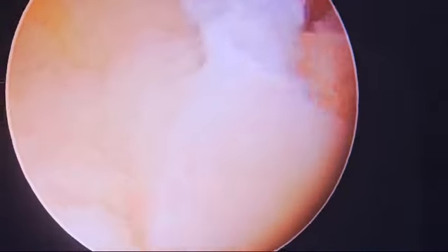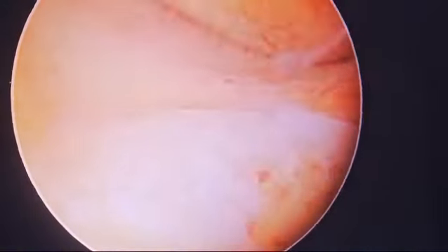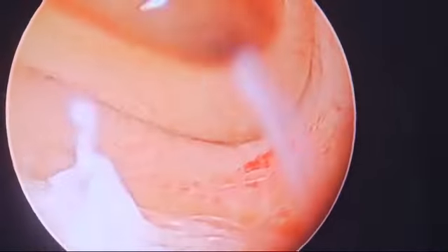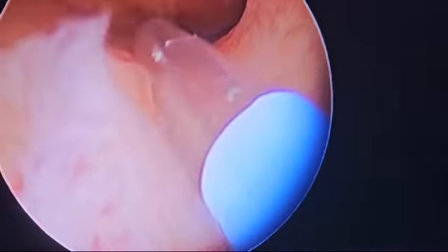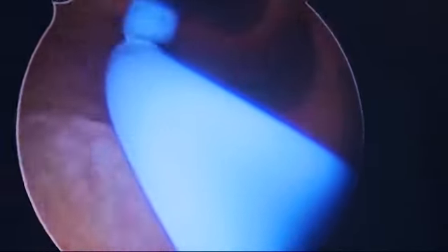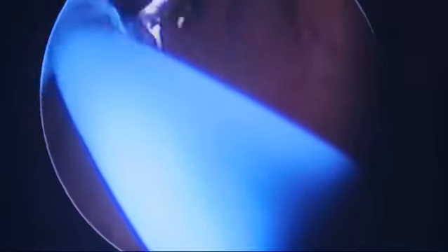Now we will try to remove the block in the left tube. We will try to cannulate the left tube as well. The bubble is giving us some tension here, but easily it has passed. The guide wire has been threaded. Mr. Neeraj will withdraw the guide wire — this much length has been threaded in the left tube.